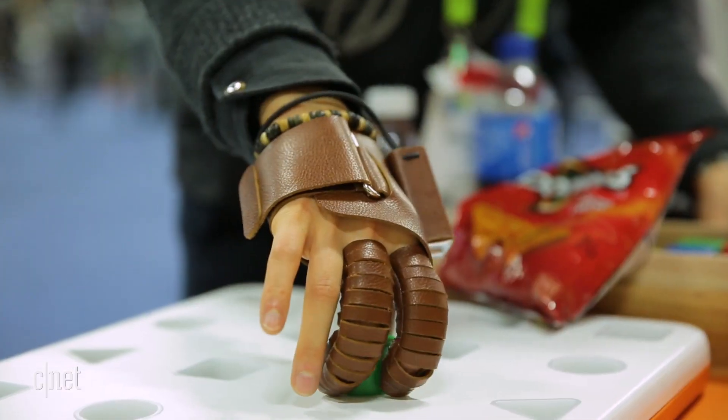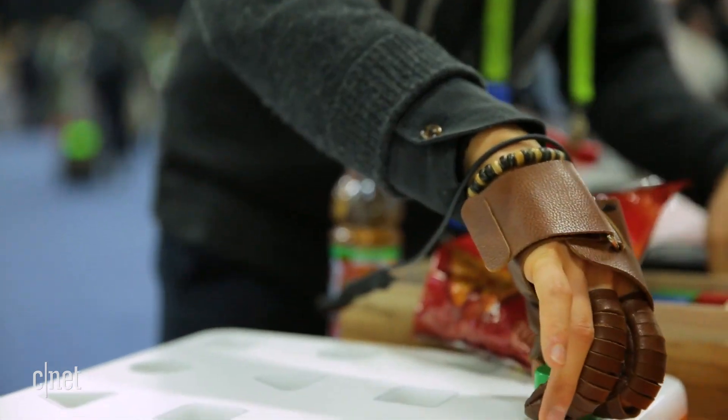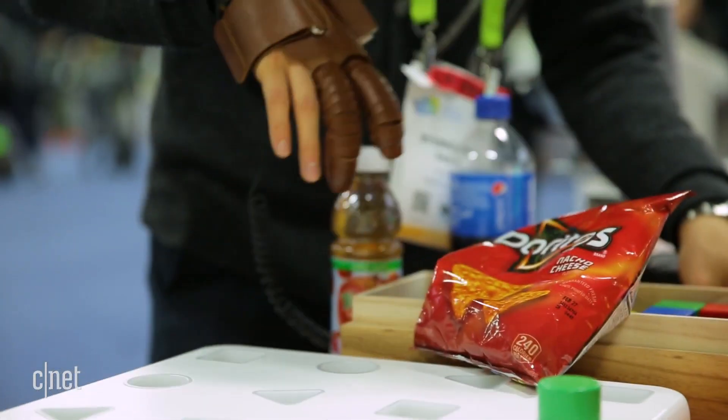This could be used for everything from mundane tasks like gripping a bottle, brushing your teeth, or picking up small objects. This is the first kind of glove I've seen like this that's come out at CES this year, which is really exciting.